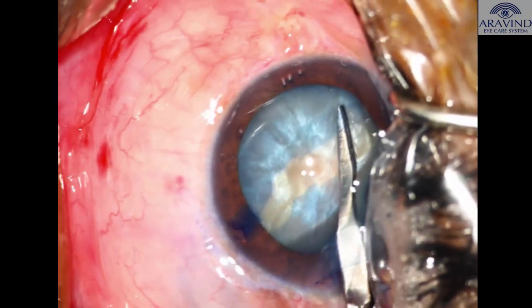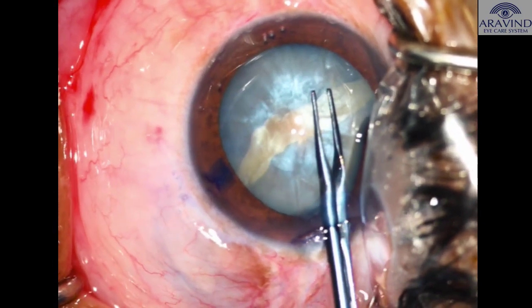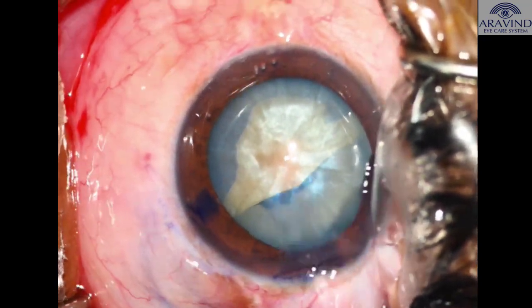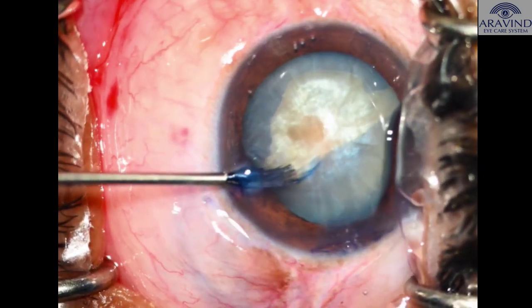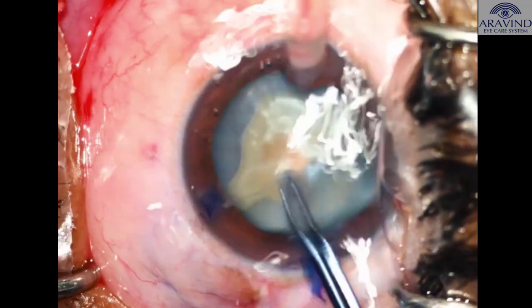To manage this, micro scissors are used to create a flap nasally, and the rhexis is completed with the help of utrata forceps. Micro scissors through the superior sideport are used to create a flap, and utrata forceps are used to complete the capsulorhexis.